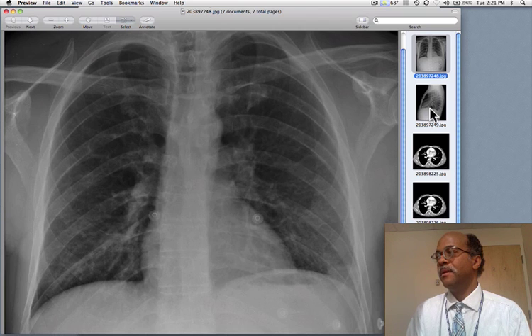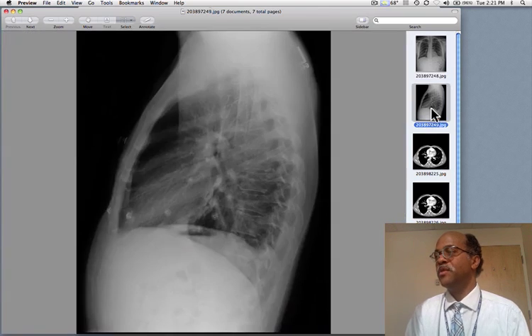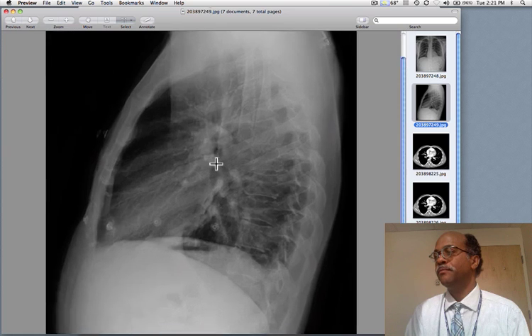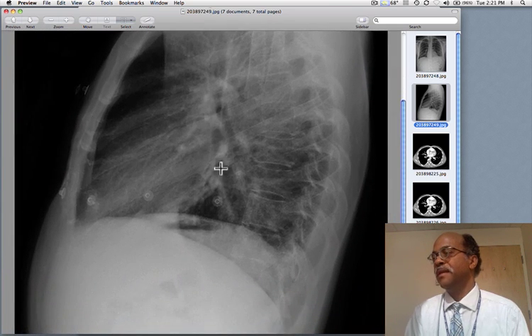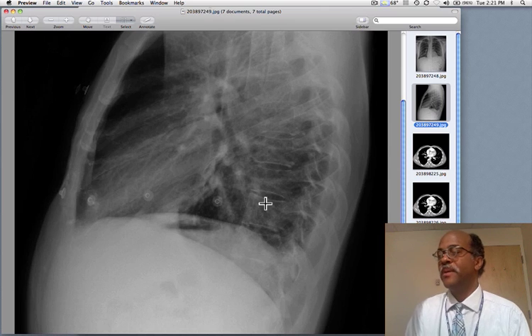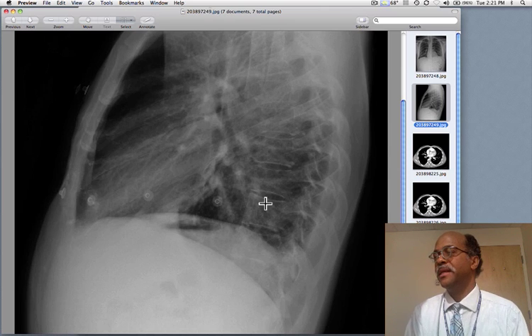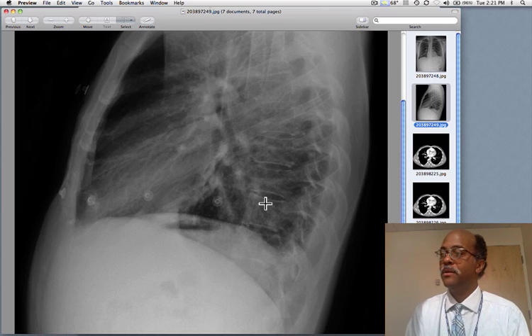If we look at the lateral projection, we really don't see very much here. There wasn't enough opacity to really create what we'd call the spine sign.